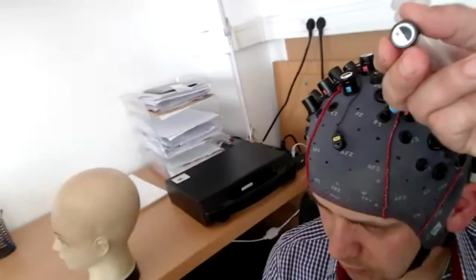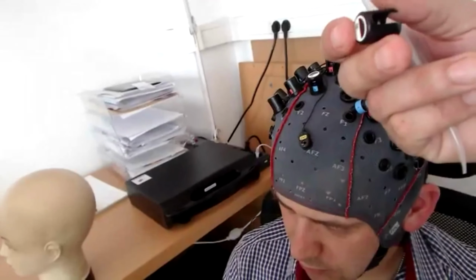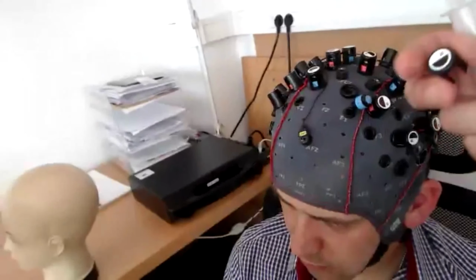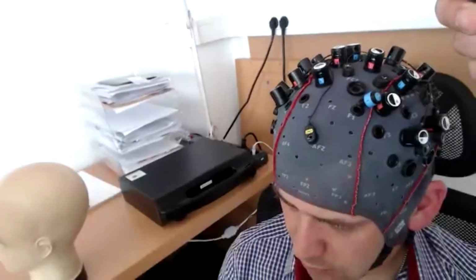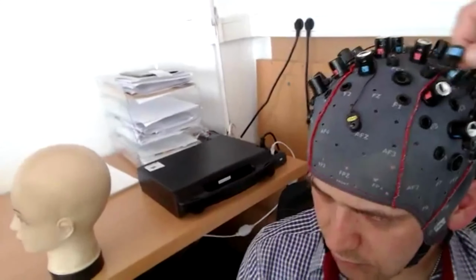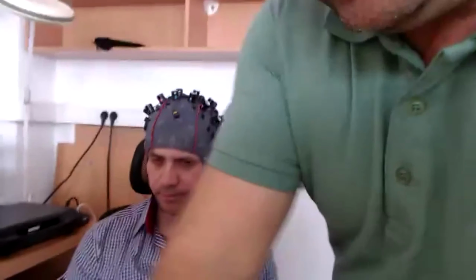So all these holders have a number written in here. So this is number 2. And this is with respect to the spring strength. So number 2 is stronger. There are 4 different types of holders, from 0 to 3, where 3 is the most powerful, the strongest spring. Okay, I will put this back. And it's very easy, just flip it.